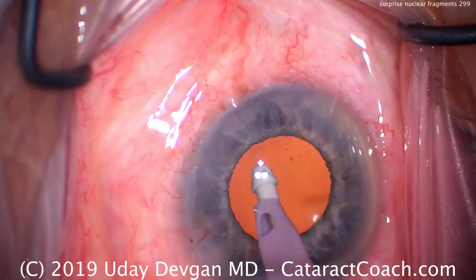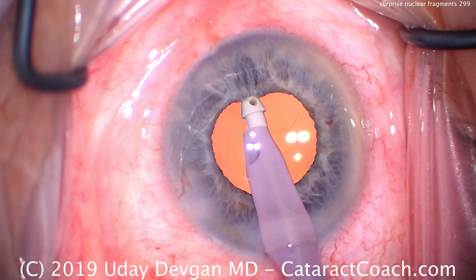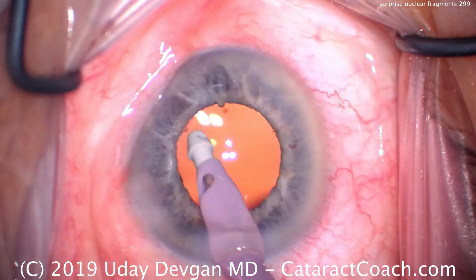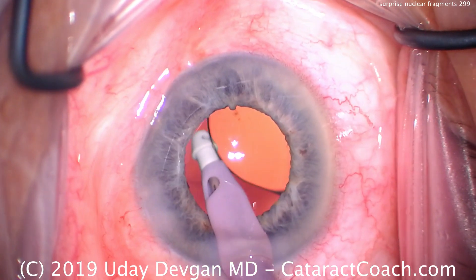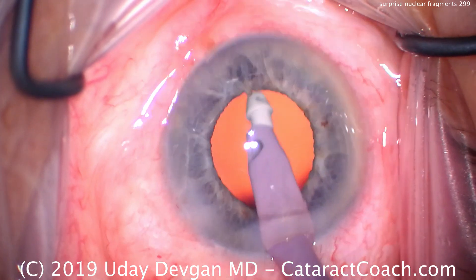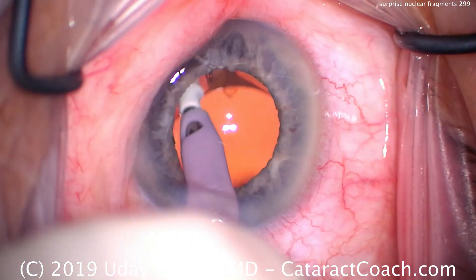Now there's one little piece left. I see that little piece floating around — a small cataract fragment. We'll leave that iris alone. There's that one piece, and there's still a little piece of lens material under the IOL optic. I'll try to lift it up and see if I can get the fluid to push it out. But no — there it is. See that one little piece?